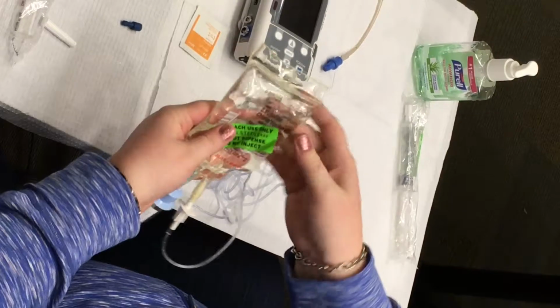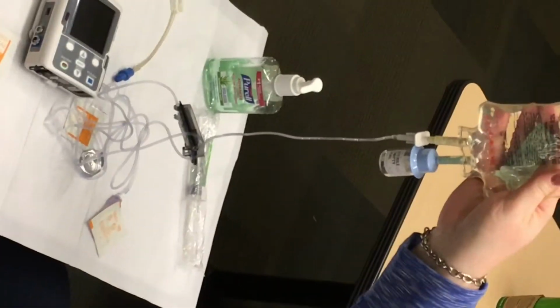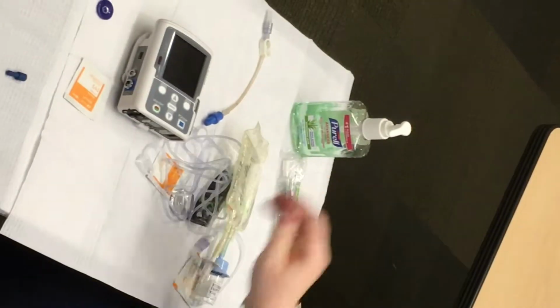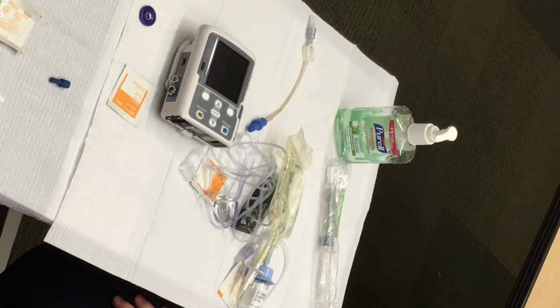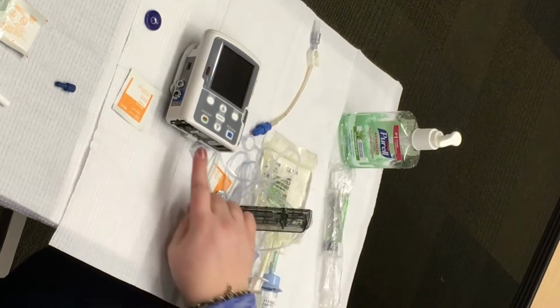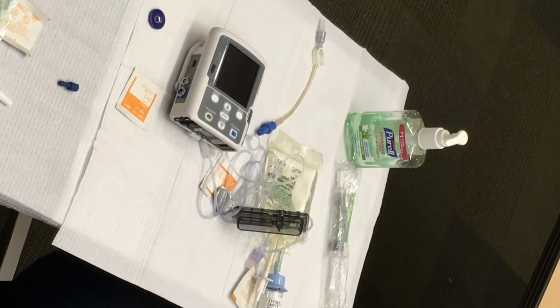Hang bag on the IV pole and attach to the pump and prime the tubing as directed in the individual specific directions given to you by the nurse who gave you the training. You are now ready to watch the videos which will review attaching, loading, and priming the tubing. If you have any question regarding this procedure, please don't hesitate to call Providence Infusion for further instructions.